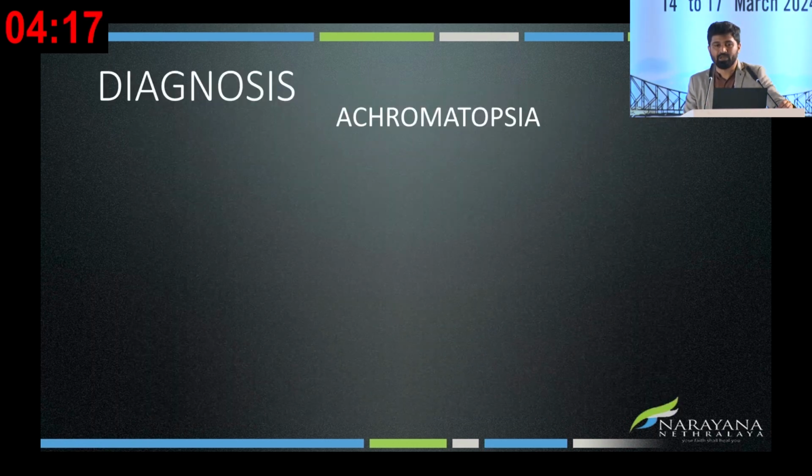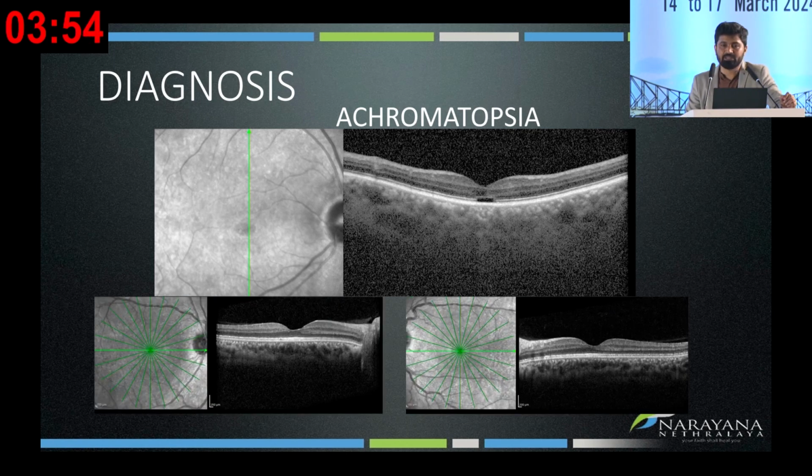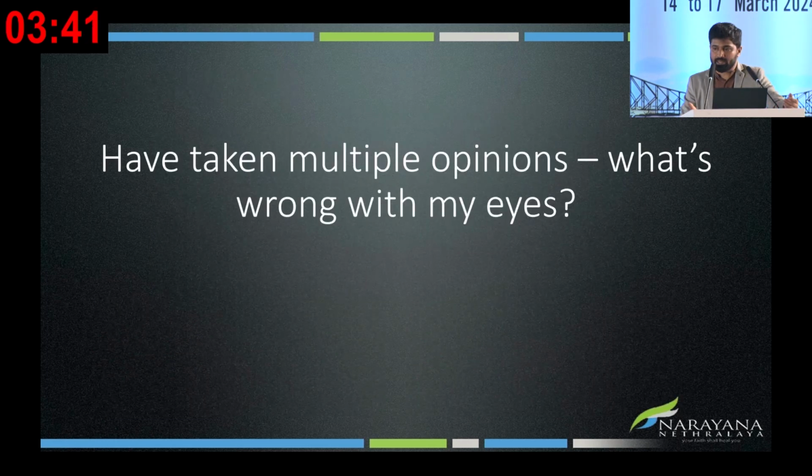So this is a classic case of achromatopsia, which is a stationary form of cone dystrophy. Again, depending on the gene involved, sometimes some patients could progress, but most of the time it remains stationary, and they don't go to a degenerative stage where the patient will develop blindness. So this is the kind of defect we see in achromatopsia. I think Simar has one of the largest series of achromatopsia, but our patient did not have even that kind of change. Usually in classic achromatopsia, you will find a defect which resembles a photic retinopathy, but it is possible in some cases that even that may not be present. Okay, so that's the last case.